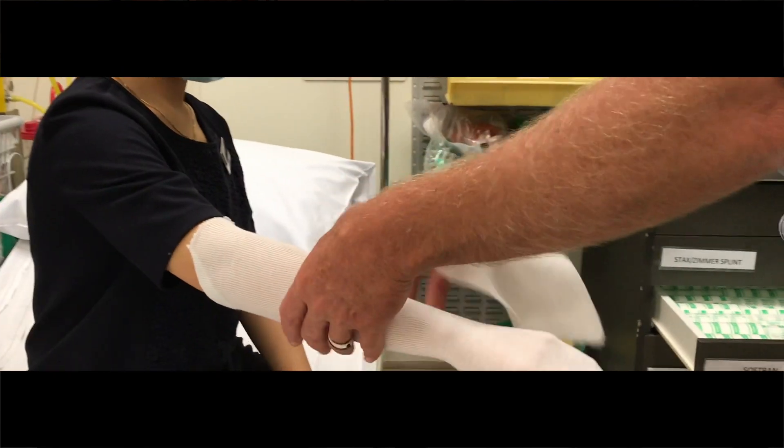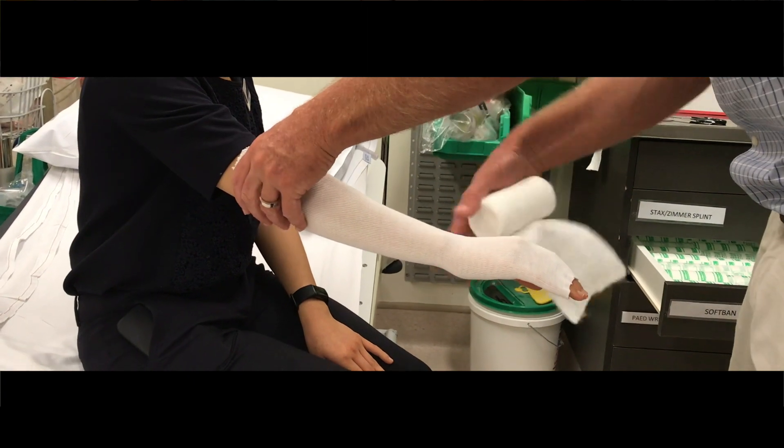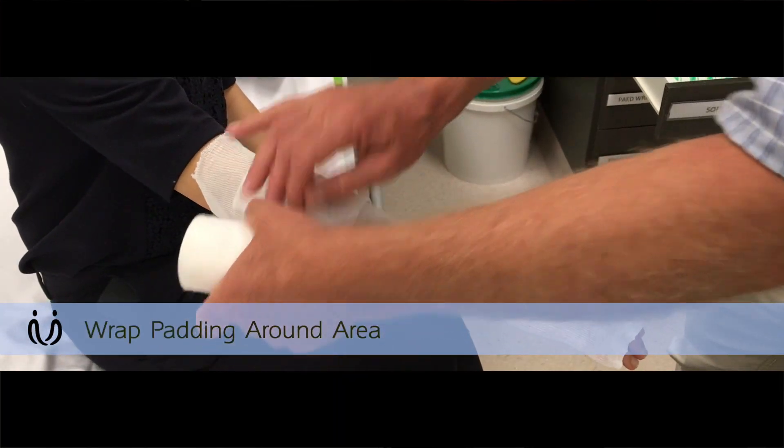You want this as high up as your plaster is going to go, and they still want to be able to bend their elbow, so I would do it up to sort of there. Nice smooth layer of that all the way around the arm.